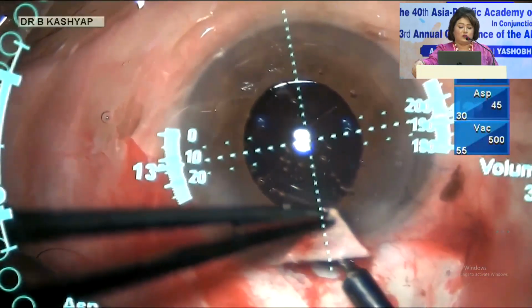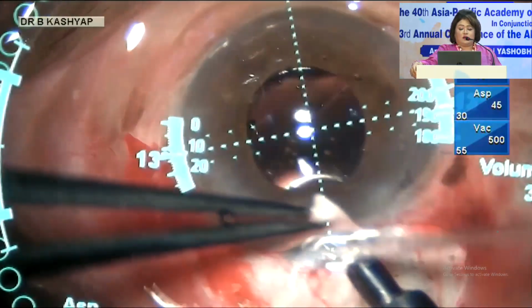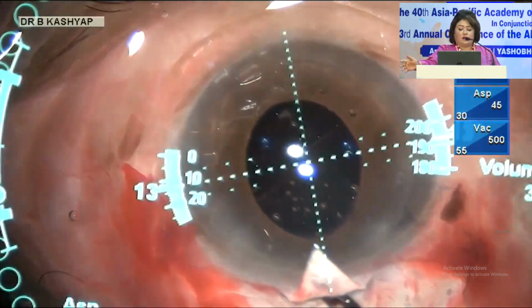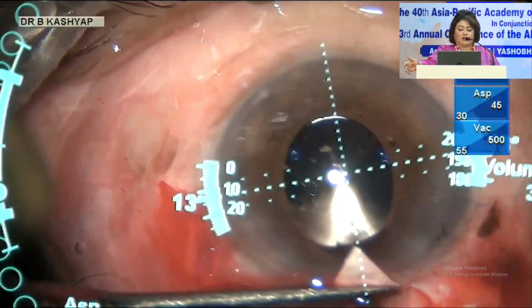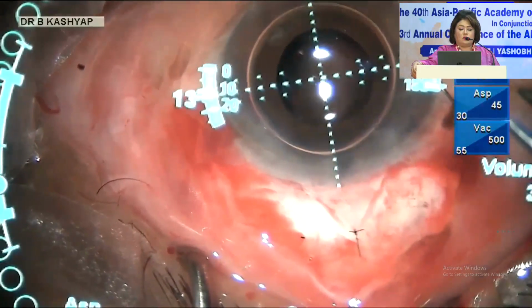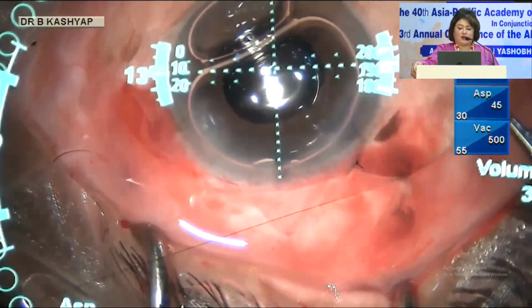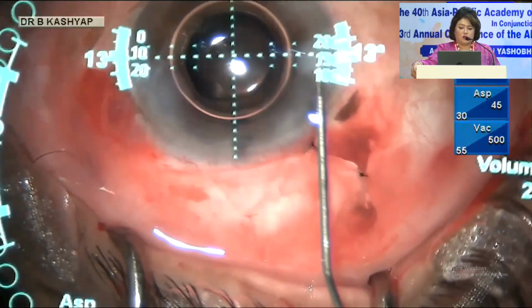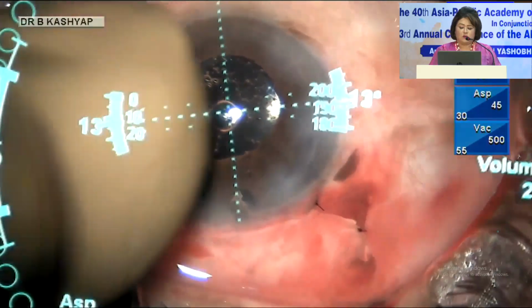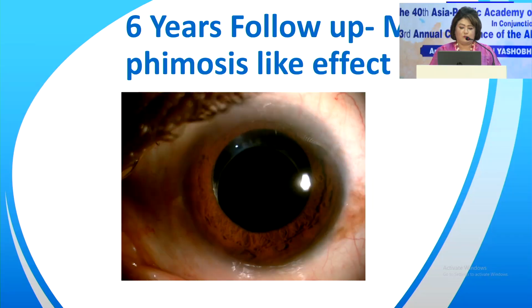This is a small video clipping. Toric IOL has been implanted, and Trab is being done with the trabeculectomy punch. The flap is sutured, the conjunctiva is sutured. You can see the 6 years follow-up of the same patient. There is a little phimosis-like effect.